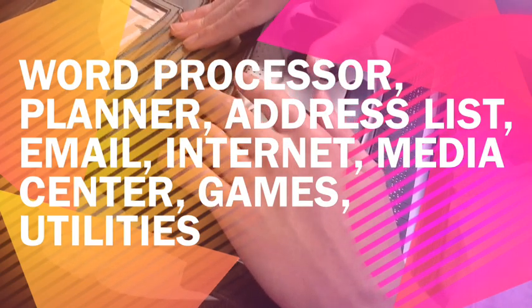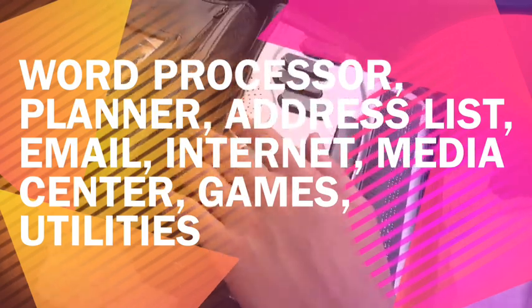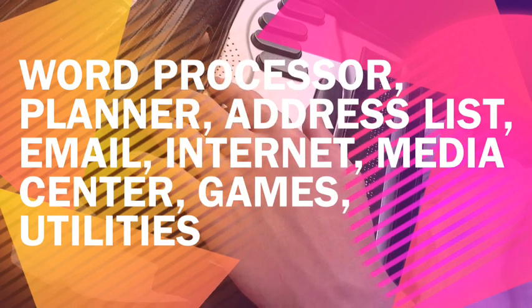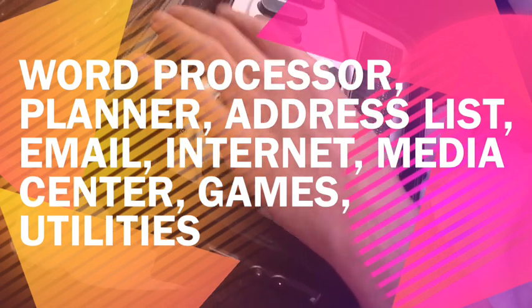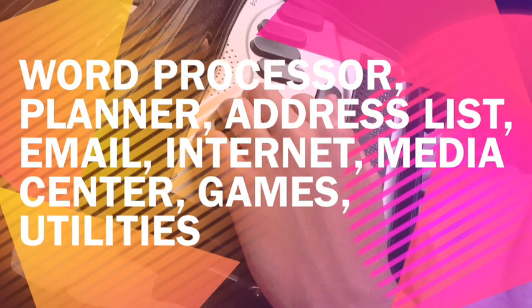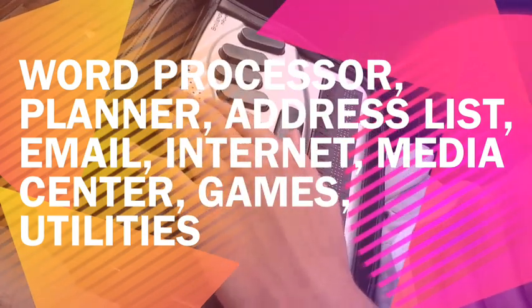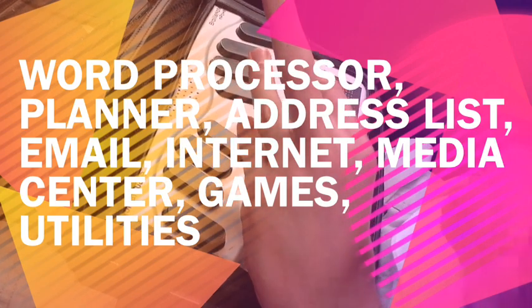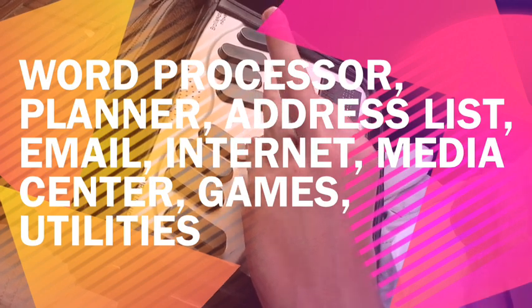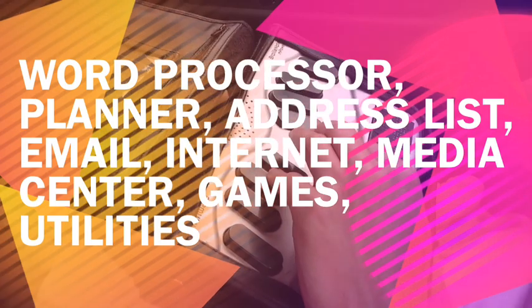Keep in mind these options do change slightly based on your BrailleNote model and software version, but they stay for the most part the same — mostly consistent, so transferring from one device to another is really easy. The Planner is basically your calendar — you can set events and appointments, and it's very powerful. The Address List lets you keep track of your contacts with the address book; in Keysoft version 9.2 if you've got an Apex. The address book is very powerful, and on other models it's pretty much the same — not much change over the years.